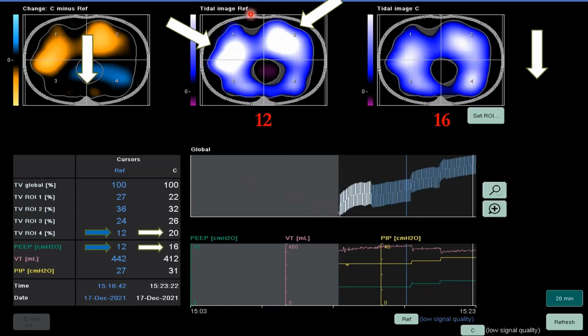So you notice here, we're not doing it in layers, we're actually doing this one in quadrants. We see the upward trajectory here, saying that we're recruiting functional residual capacity. And to be honest, we see this even just with the 12 going up here. We could have been patient and waited for this recruitment to happen on 12 completely to straighten out, and then after go to the next one.